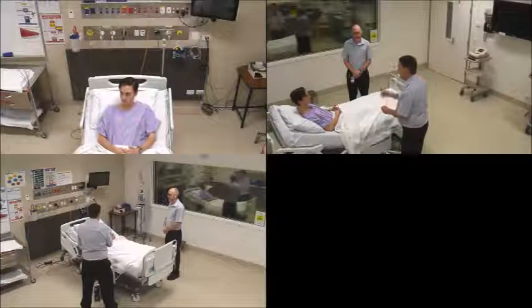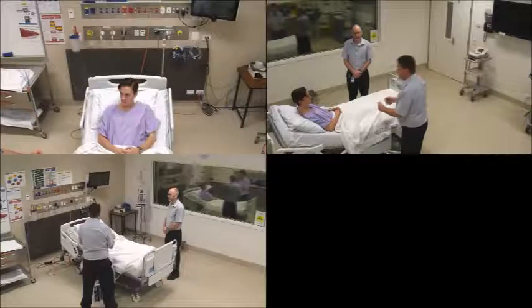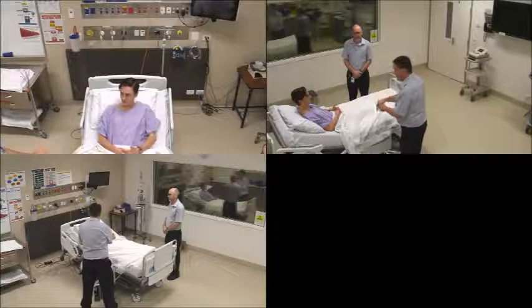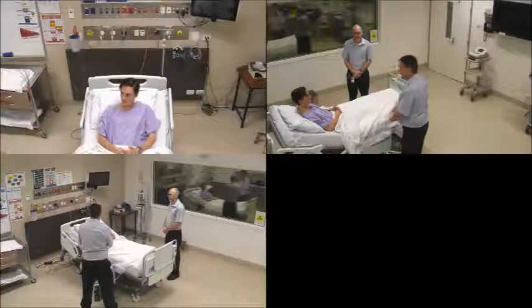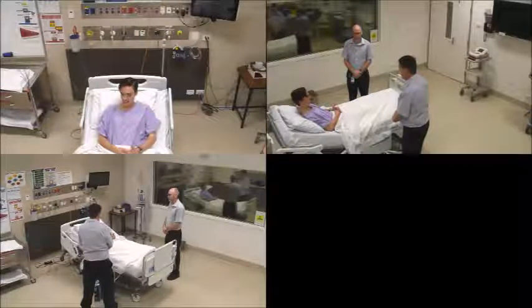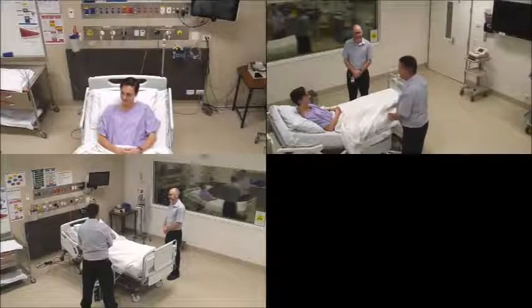Now most people say that when we're taking the drain out and pinching, that's what causes most of the pain because I'm actually pinching your skin. But what that does is it helps us to prevent air from going back into that lung cavity. Once the steri-strips are on and the dressing's over the top, my fingers will come off, and everything should feel okay. Any questions so far? No? Okay. I'll explain more about the procedure as we go through, if that's okay.